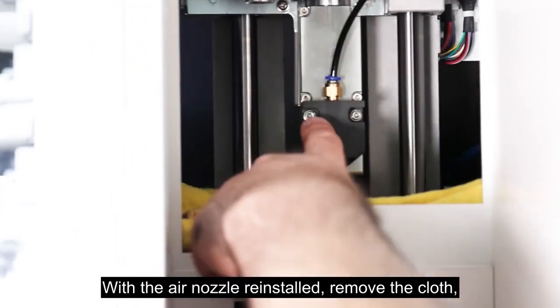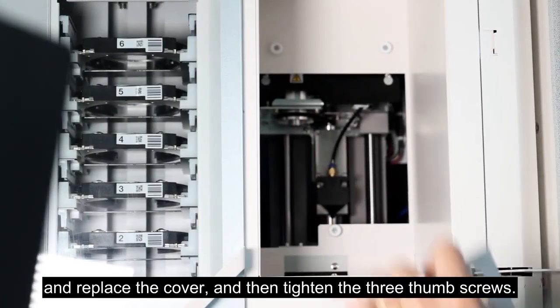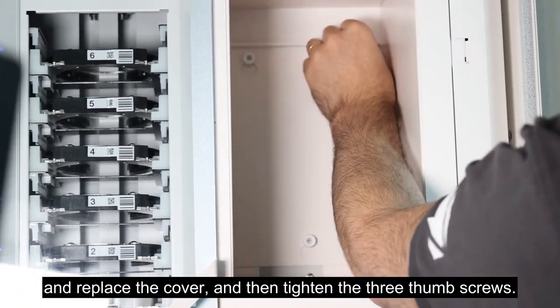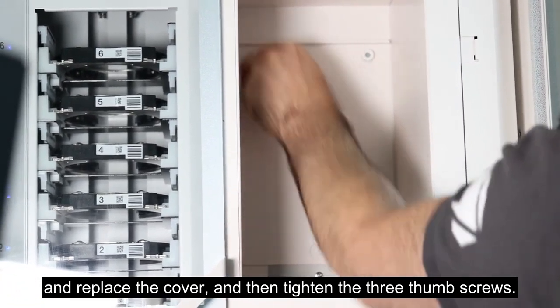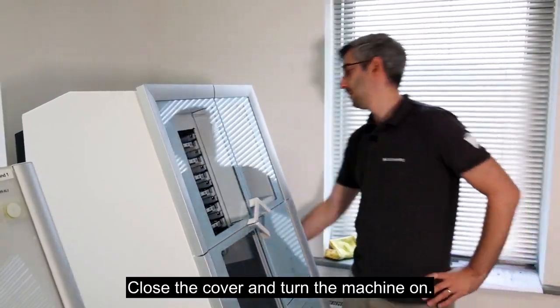With the air nozzle reinstalled, remove the cloth and replace the cover, and then tighten the 3 thumb screws. Close the cover and turn the machine on.